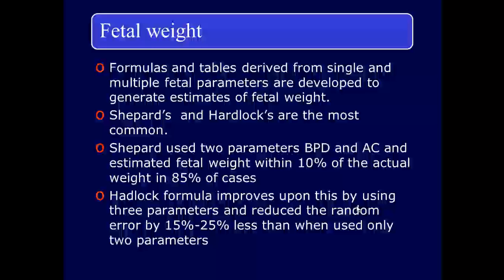Once parameters have been measured, an estimate of fetal weight can be made. Many researchers have published fetal weight formulas and tables derived from single and multiple fetal parameters to generate estimates of fetal weight. Shepard's and Hadlock's are the most common.